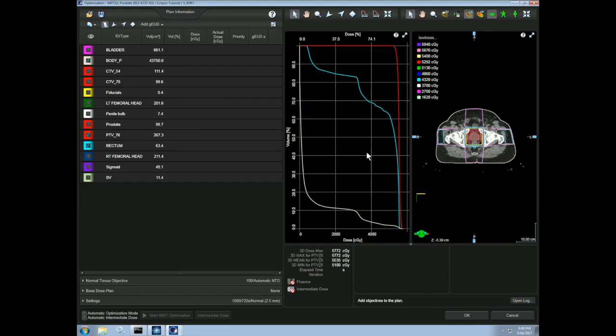The center here is a DVH that allows us to see how well our constraints are being met throughout our optimization process. The rightmost screen shows one plane of the patient and shows the isodose lines as our optimization progresses.